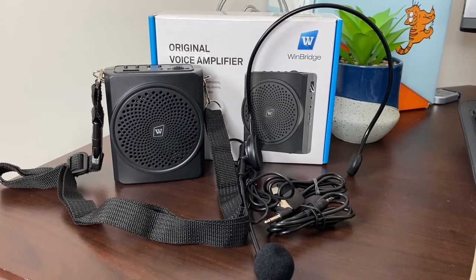So here it is, the original voice amplifier. This is basically just like the one that I reviewed a couple of months ago except it is a different series. I did a very detailed video so I'm not gonna go into every single thing in this video. If you are interested in learning more about those specific things, please check that video out here.